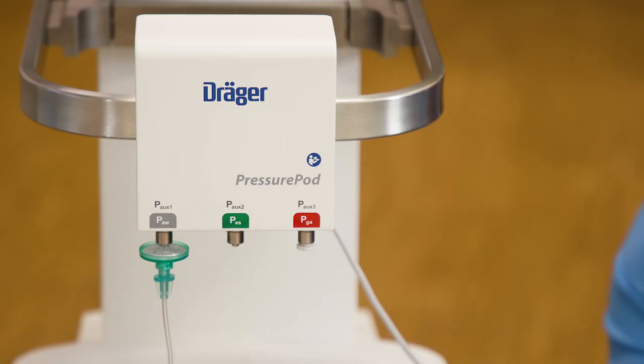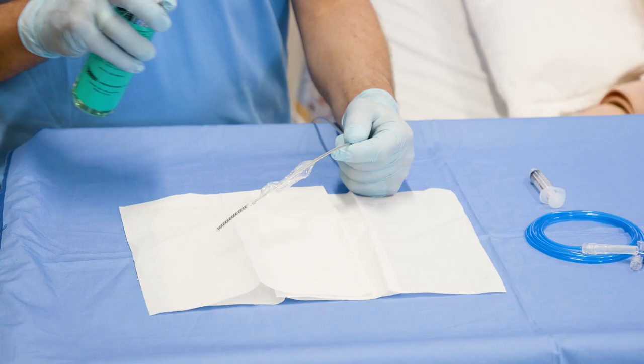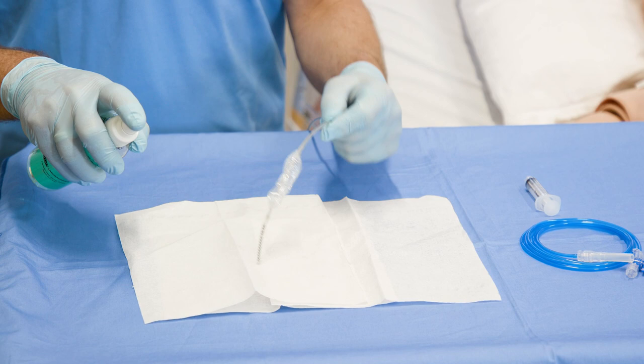We connect the extension line to the esophageal port at the pressure pot. To improve the sliding of the probe, consider applying a lubricant at the tip of the probe if appropriate.